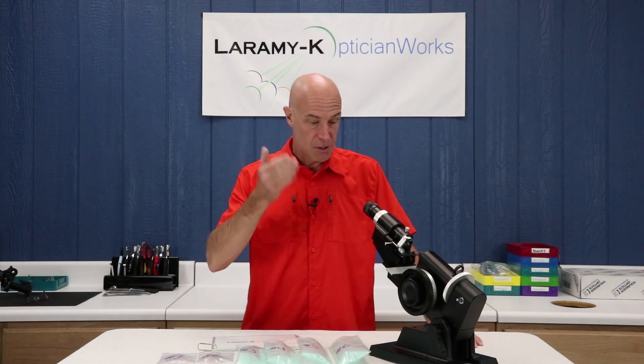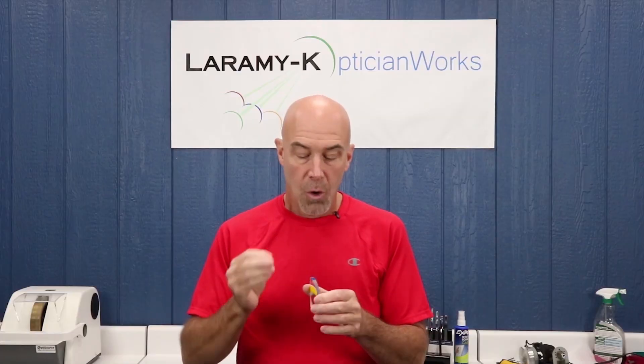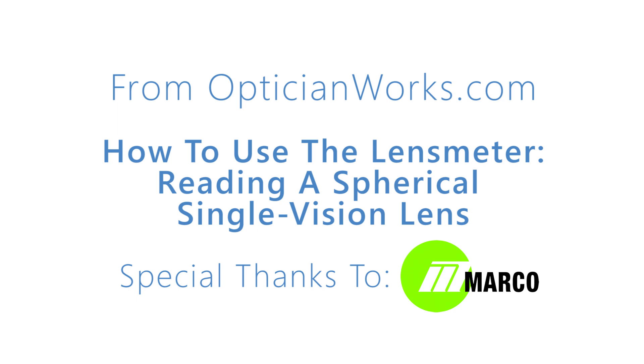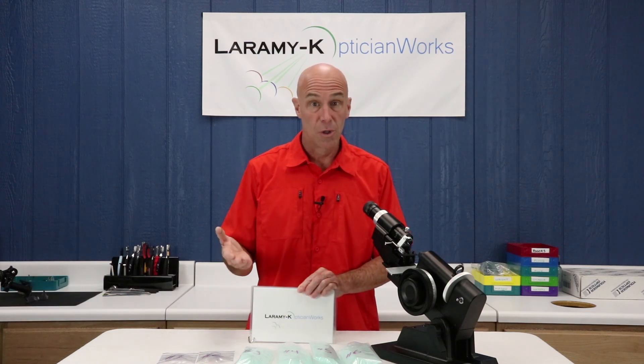Hello and welcome to part two in our ongoing series of Let's Learn How to Use the Lens Meter. From this point forward in this particular series, you're going to be working with our Learn the Lens Meter kit. The kit is available online at the OpticianWorks website.